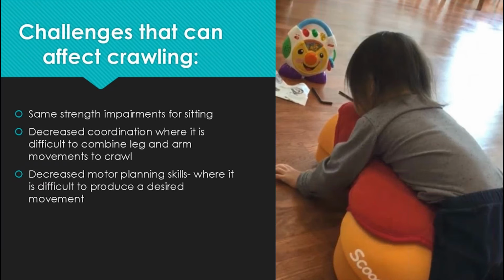So they haven't had to put an additional strap around her trunk to keep her safe; she's been able to maintain this tummy position on the scoot. If you're concerned about your child rolling off the scoot and want to add stability, some strategies that therapists and parents have used are a Velcro band around the trunk going around the bottom of the scoot, or a neoprene band or a TheraBand around the trunk, which also gives some input into the scoot, so they understand that they have to keep pressing down on the scoot if they want to stay on it.